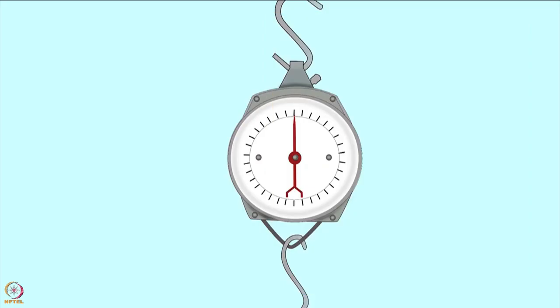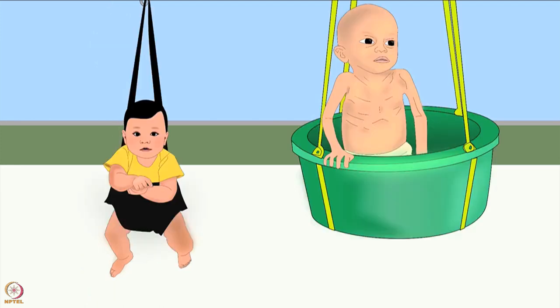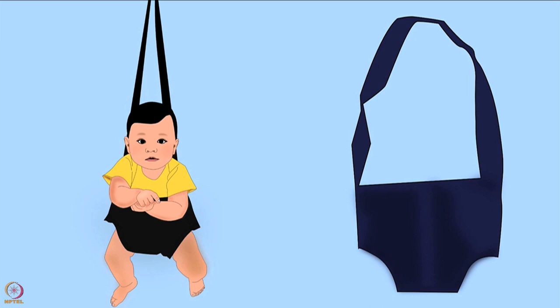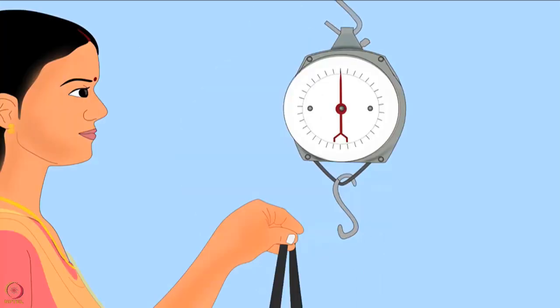Let us learn how to measure weight using a salter scale. The salter scale is a spring hanging scale; it can weigh up to 25 kilograms. To measure weight you will need weighing pants or a bucket. In this tutorial we will be using weighing pants. Before weighing the baby, attach the pants to the scale.